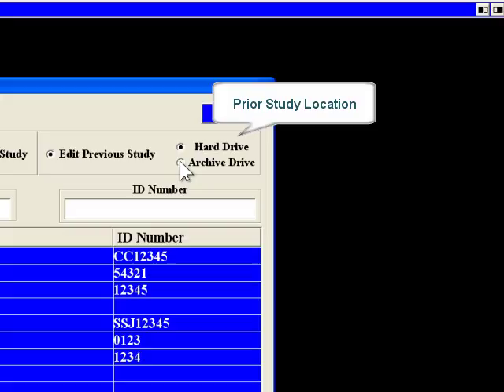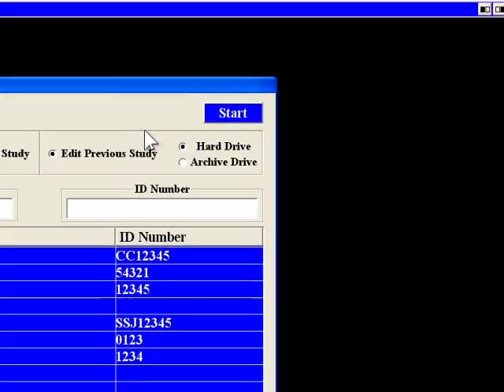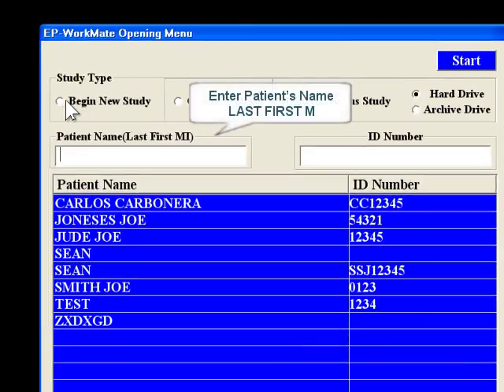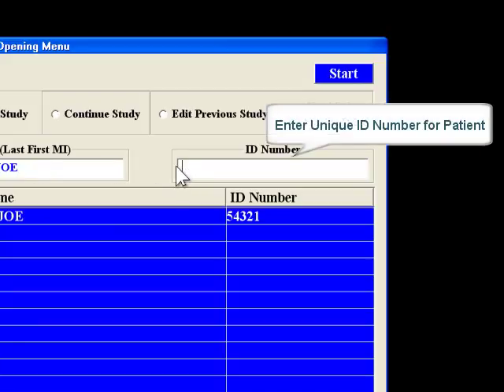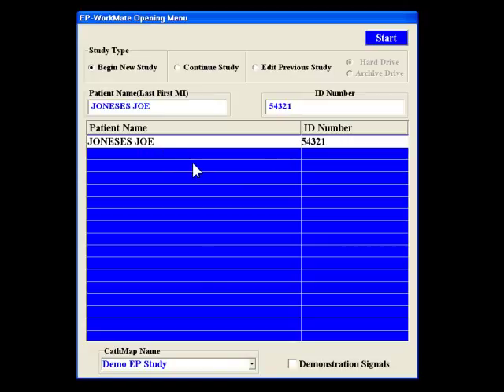The previous study could also be on a DVD or a server. When you're starting a new case, you need to enter the patient's name — last name, first name, middle initial — and it's important that you don't put any commas between those names, just spaces. You can also enter the patient's ID number. If the patient has been here before, they will show up on the list in the main body of the menu. You can select a patient from the list, which will reload all the patient's demographic information and allow you to start a new study for a pre-existing patient.